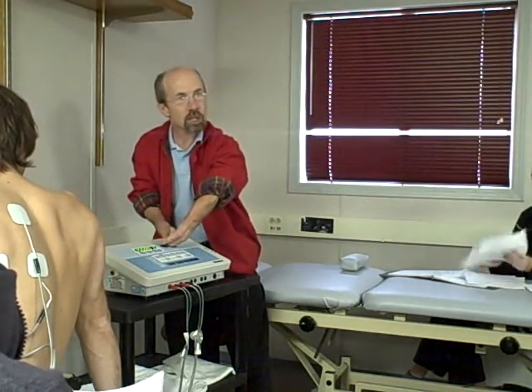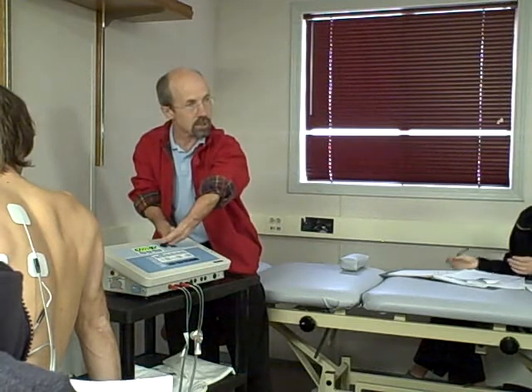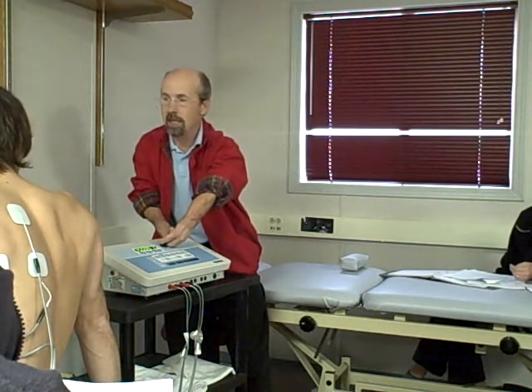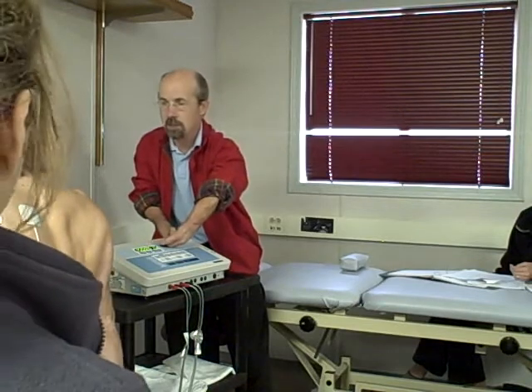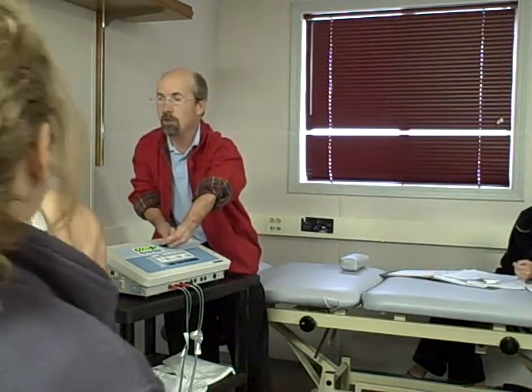That's what you want. You get the patient up, you've got to get a response. You've got to know when they feel it. All right, okay, now let's take you up. Oh, you did, okay, all right, I need to know that. So, are you uncomfortable?